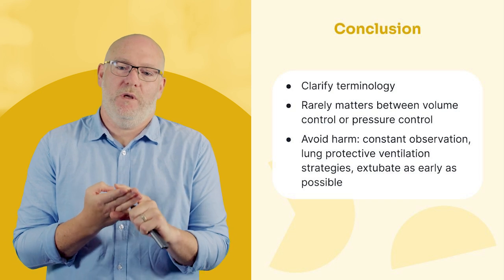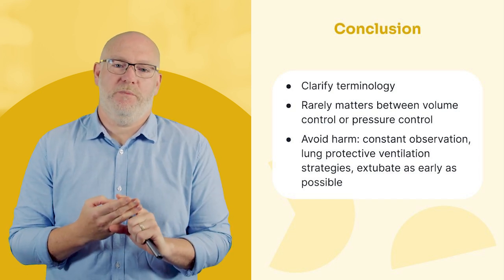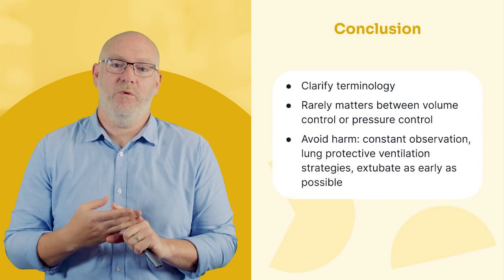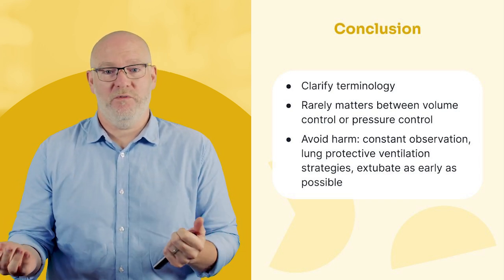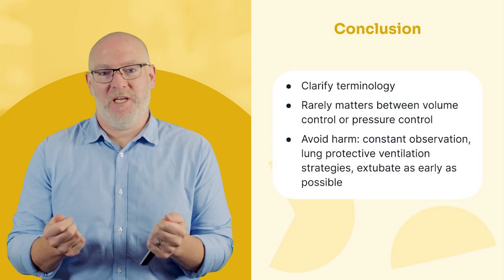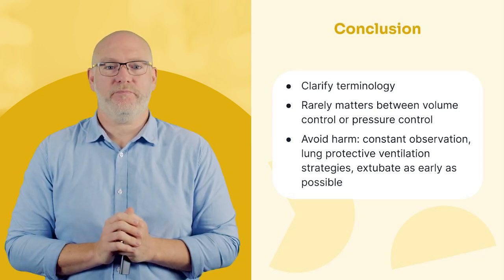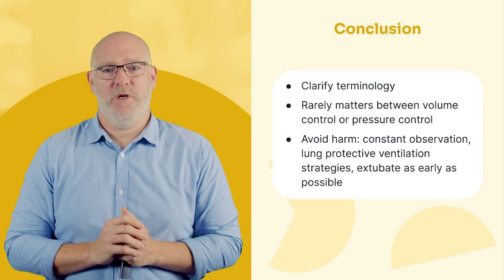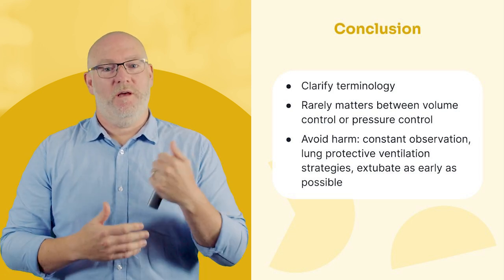So having a good grasp of some of these key terms we've covered today will really set you up in good stead to have these conversations with people when they're talking about a new particular mode of ventilation that you may not have heard of before. I promise you it's probably going to come back to some of these basic principles, and if you can understand that, you'll be fine. It very rarely matters between choosing volume control or pressure control because you're delivering one and monitoring the other.